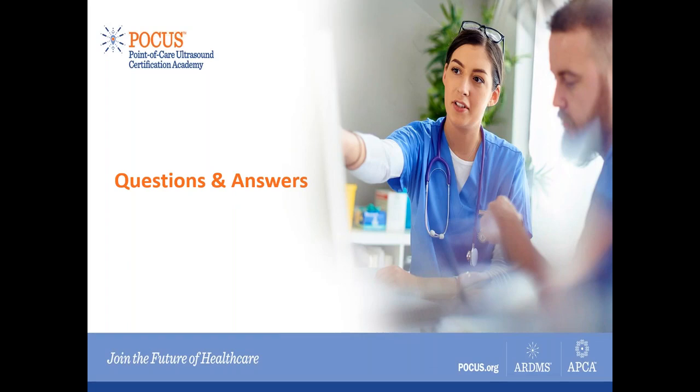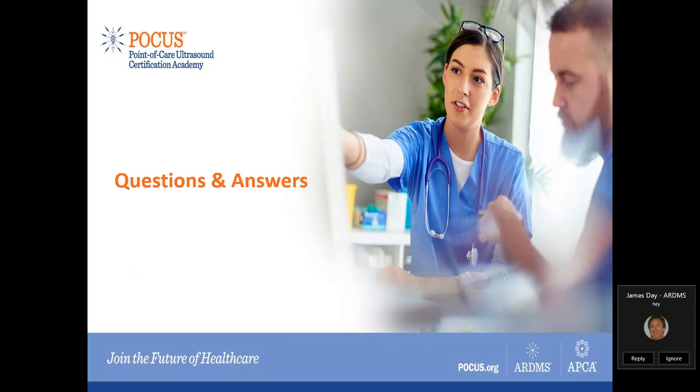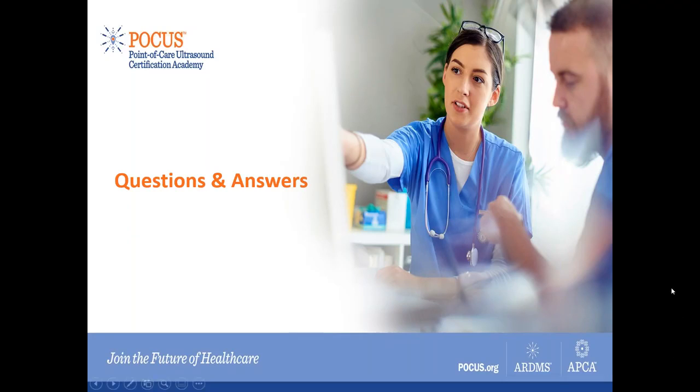Yes, absolutely. As I mentioned, an aneurysm anywhere in one of the large vessels or even a peripheral vessel. Basically, aneurysm anywhere in the body. So if you're doing an echo and you happen to be seeing an aneurysm, say in the ascending aorta, root of the aorta, or the descending thoracic aorta, then the bells should go on and you should be alarmed and you should be looking for an abdominal aortic aneurysm too. So I hope that answers the question.